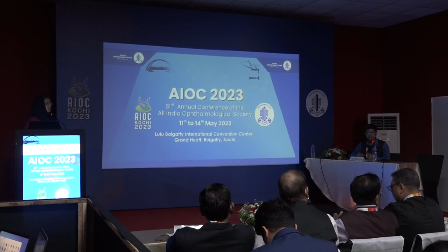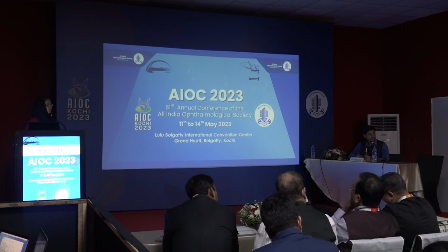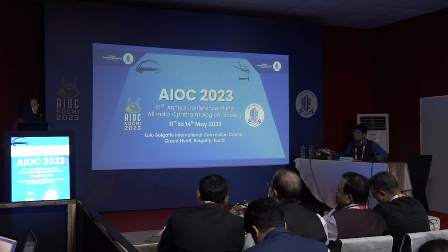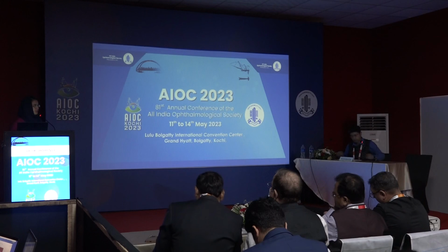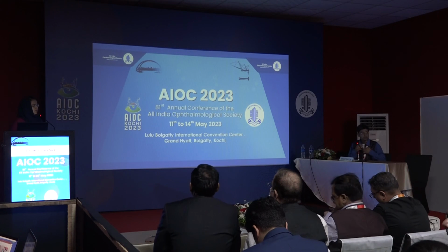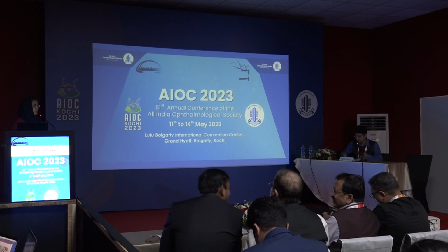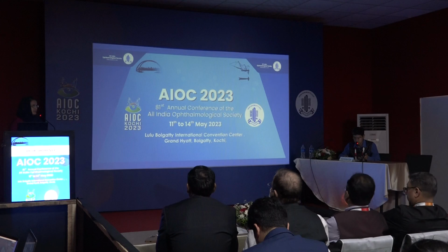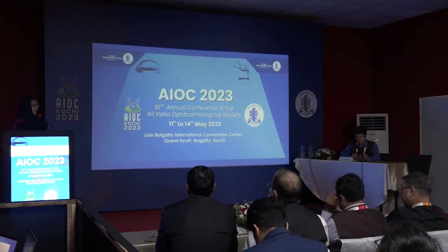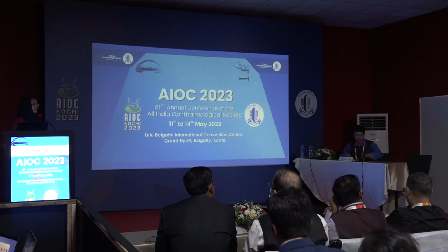Yes, Dr. Ramesh. I am not a cataract surgeon, but why 5 ml blood loss in cataract surgery and why do you have to use this in cataract surgery? Because that was the first indication you said. The main use in cataract surgery is pooling of fluid in the deep socket when we are doing cortex aspiration. So most of the time during surgery, the sister tries to mop the fluid with cotton, or she tries to pull it using a syringe. So if this equipment is available, either the surgeon or the assisting nurse can easily aspirate the fluid.